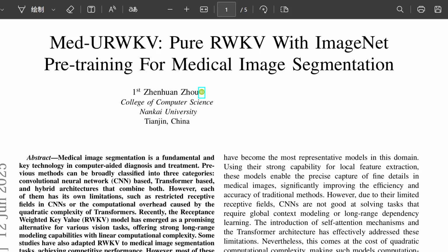The main limitation is what's called a restricted receptive field. Basically, each part of the network only sees a small piece of the image. It struggles to grasp the bigger picture. Like seeing the trees but missing the forest. Exactly. Understanding how distant parts of the image relate, global context or long-range dependencies, that's tough for a standard CNN. Right. It might see a lesion perfectly, but struggle to relate its position to, say, a major organ far away in the scan without lots of complex layers.